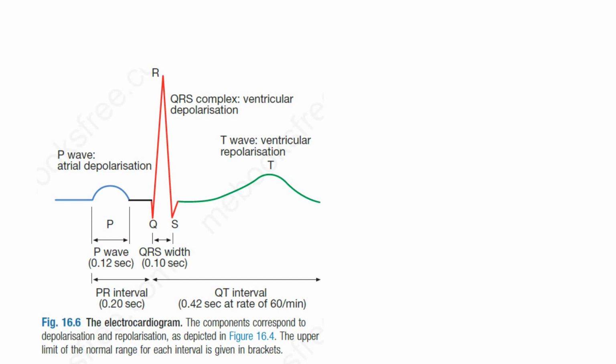When we think QRS complex in amplitude, large QRS complex occurs in slim young patient and in patient with left ventricular hypertrophy.